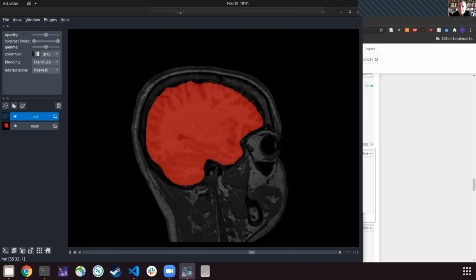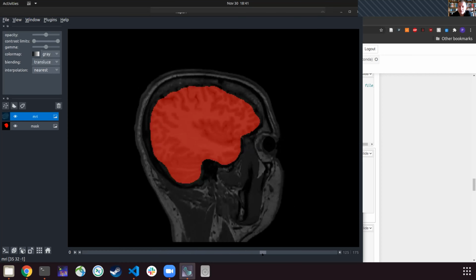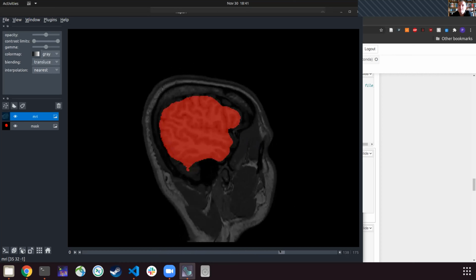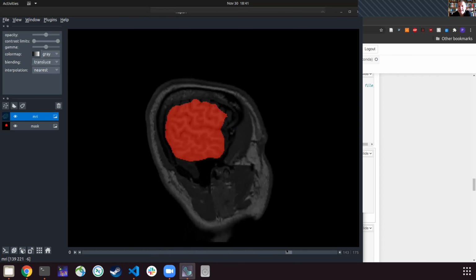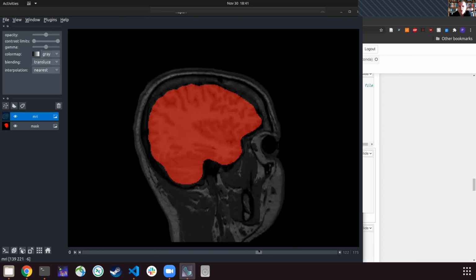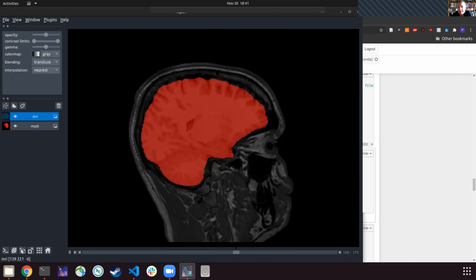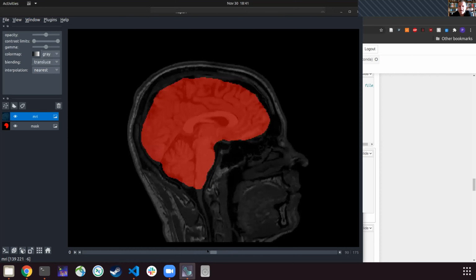Compare that with one of the most widely used algorithmic brain extraction methods called BET, which is a very, very fine tool, I need to stress. But the thing with BET is that it would probably take about 2.5 minutes. So it doesn't sound like very much for a single image, but when you're dealing with tens or thousands of images, this tends to take a lot of time.